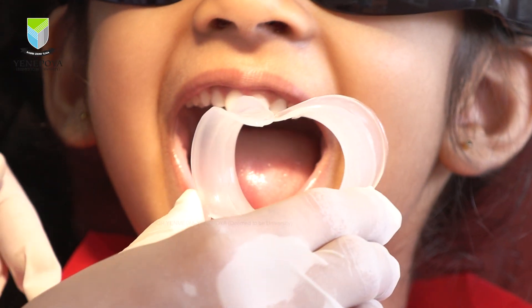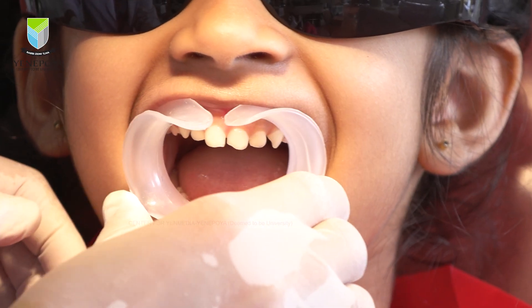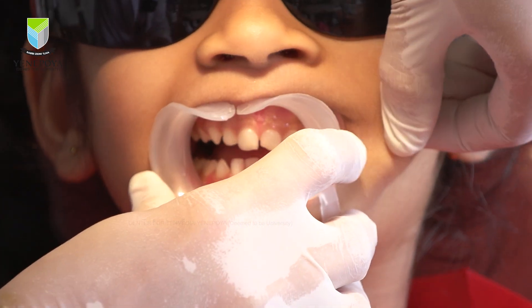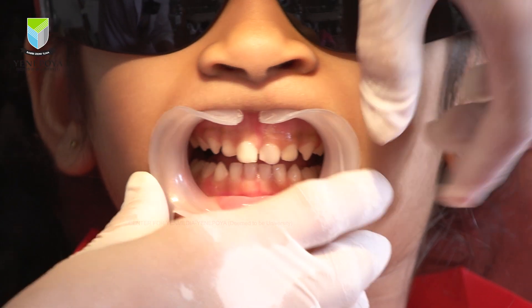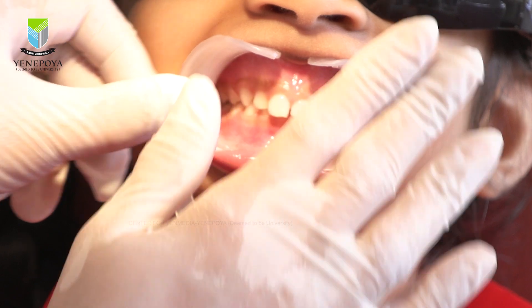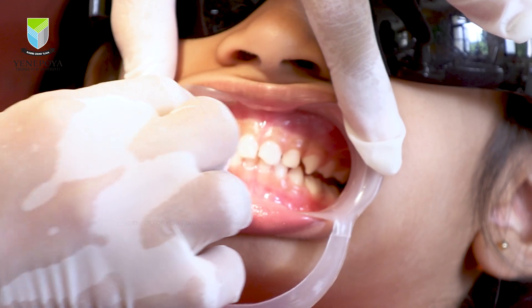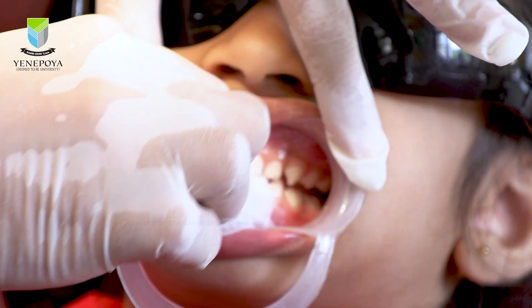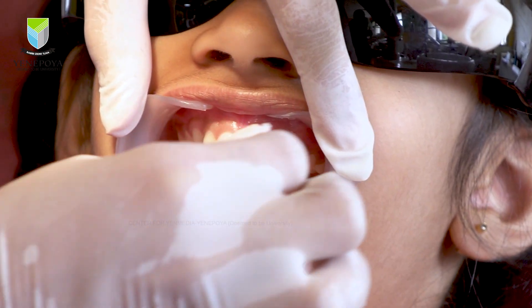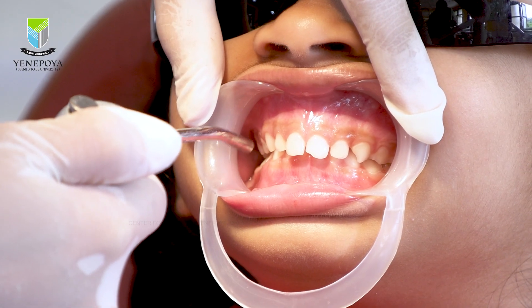Before drying, I usually prefer to use a cheek retractor to keep the tissues away as it is a lot more convenient, but if the patient isn't comfortable with it, alternatively you can use fingers to raise the lip at the corners of the mouth and then dry the tooth. There are two ways of drying teeth: you can either use a 2 by 2 inch gauze square to dry the surface all around, or you could simply use the air water syringe.